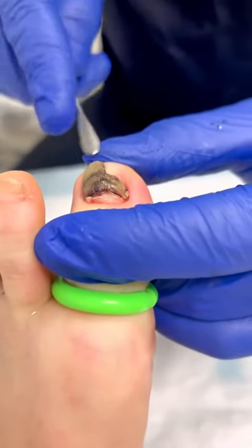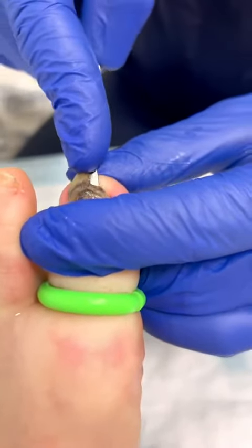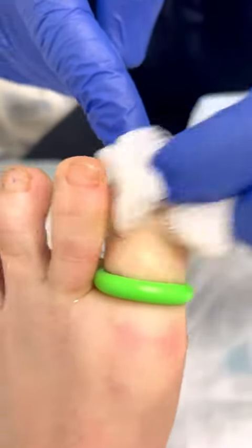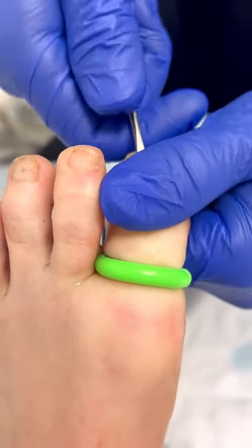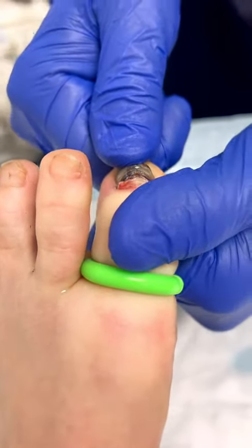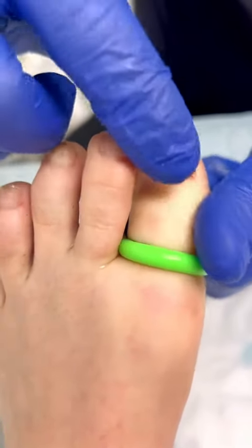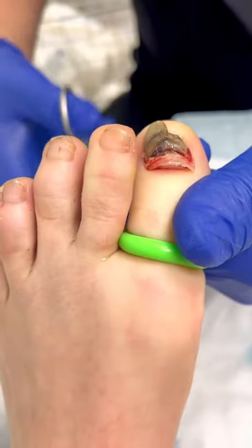Now that we've got the top loose, we go underneath. And once the freer is under, now that we've loosened everything up, we do this little maneuver where we literally just pop the nail. The nail pops, and then the only thing that typically attaches is the very tip of the nail.